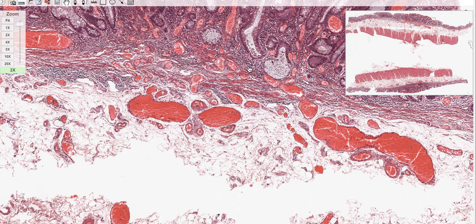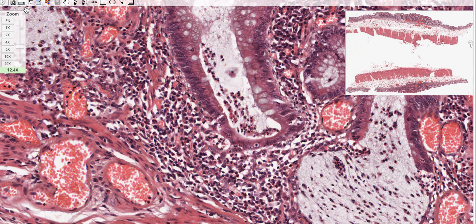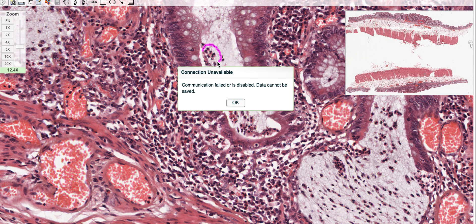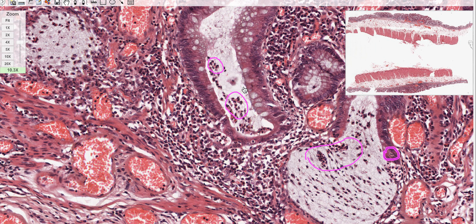Zooming in on the crypts further into the lumen: in the lumen of the crypt you can appreciate there are few cells. These cells have lobed or bent nuclei - they are neutrophils. You can also appreciate a neutrophil in the wall as well. So I have cryptitis in the wall and neutrophils in the center of the crypt. Just as a lump full of neutrophils in the center is called an abscess, this same finding in a crypt is called a crypt abscess.